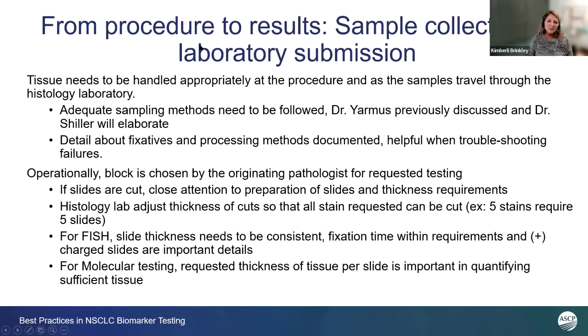So there's a lot of pieces and parts that go into play as we are moving stepwise down the process of sample collection into the laboratory, and then from the laboratory all the way through to the testing group inside the laboratory. That's such a great explanation, Kim.